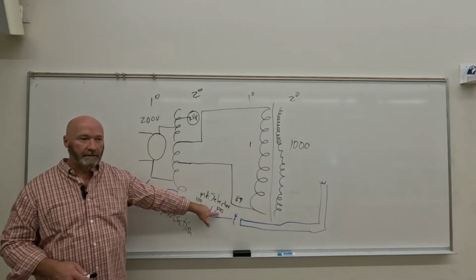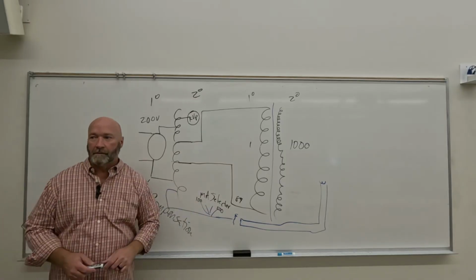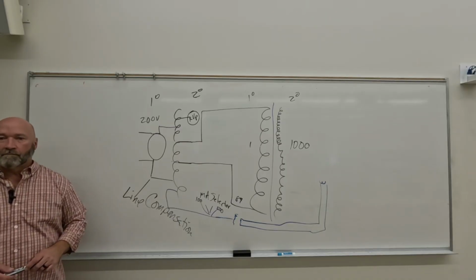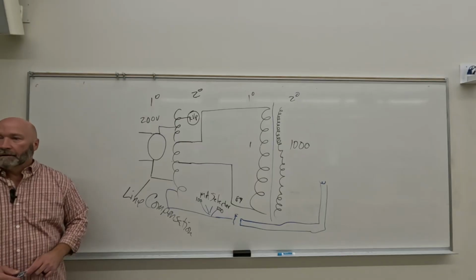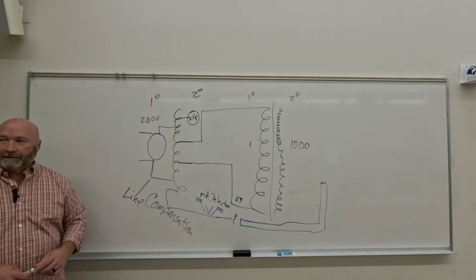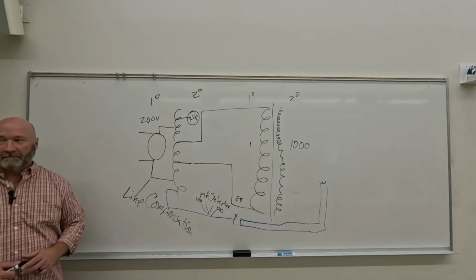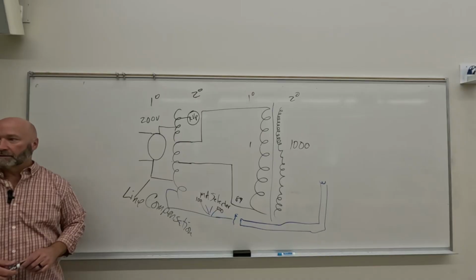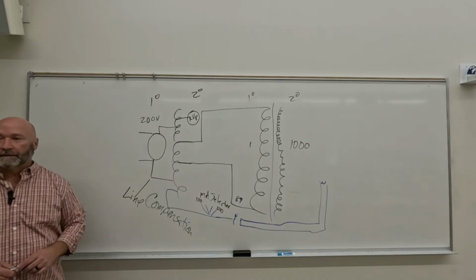Yeah, right? What if we used 100? In a word, what would I need? More. Yeah, I need more time, right? So is there a time to use that long exposure time? I haven't really gotten into any of those procedure types, but yes, there actually is. There's what we refer to as autotomo, and I'll explain what that means later on.